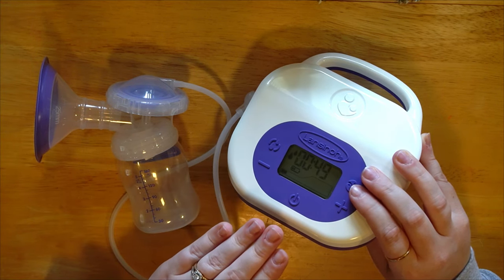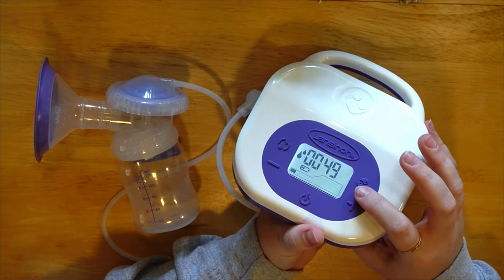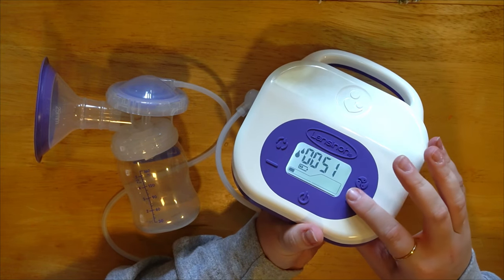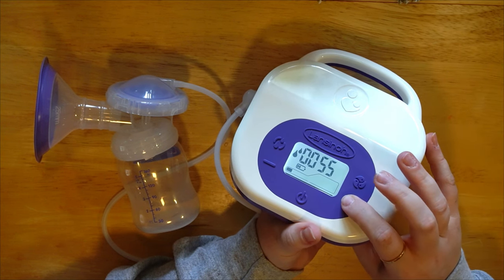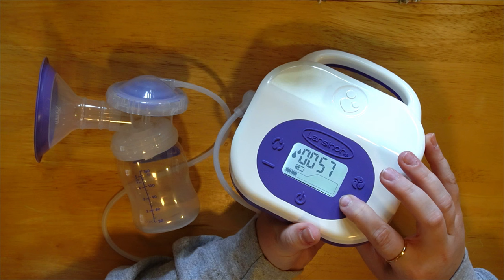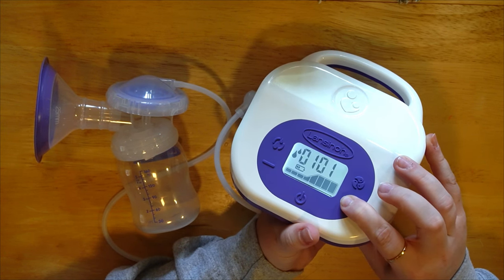We need to find a setting that is comfortable enough to sustain throughout your entire pump session and also effective at drawing milk. Start down low, sit there for a few seconds to see how it feels, then slowly increase just a little bit at a time. This pump has some intense suction at the higher levels.